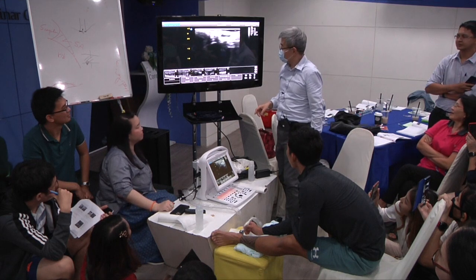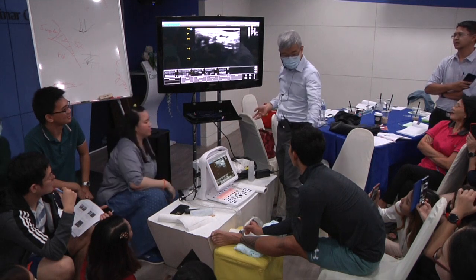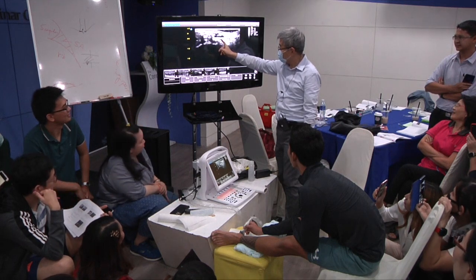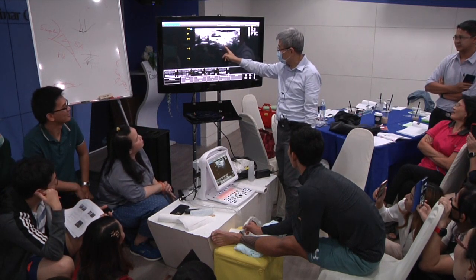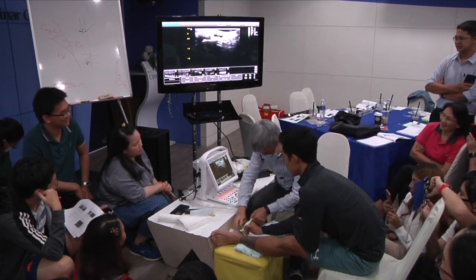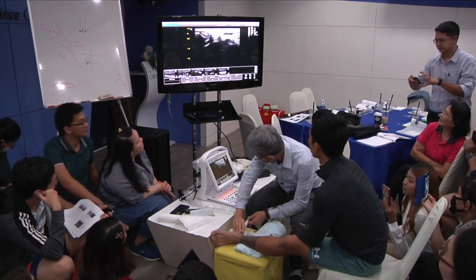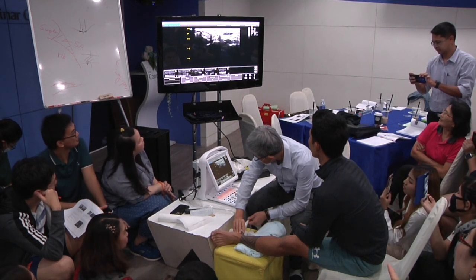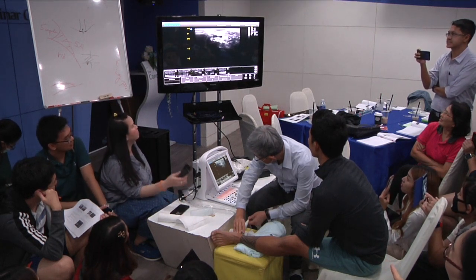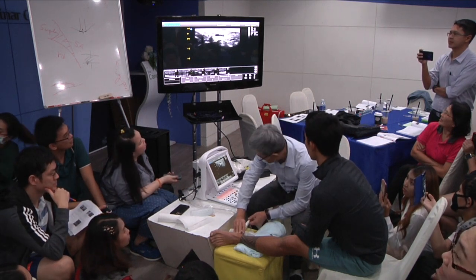Good. I didn't expect this is so easy. I know it's easy, but it's so easy. Okay, good. That's the artery. That's the nerve. The flexor hallucis tendon is here. Okay, I will take your hands. Then you carry out the flexor. Right? Tibia posterior, flexor digitorum, nerve, artery, nerve. Then you need using tilting. Look. Okay.